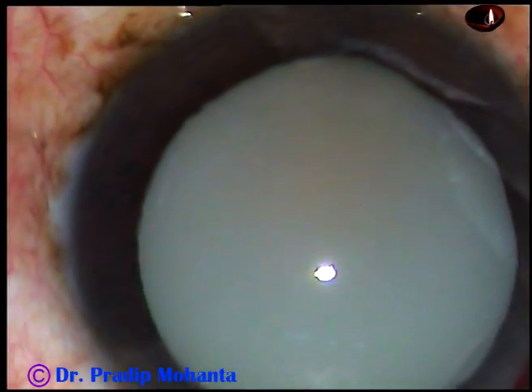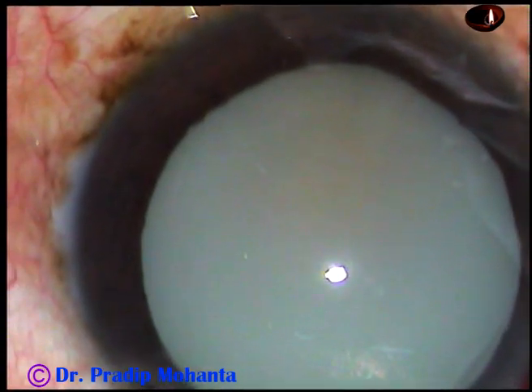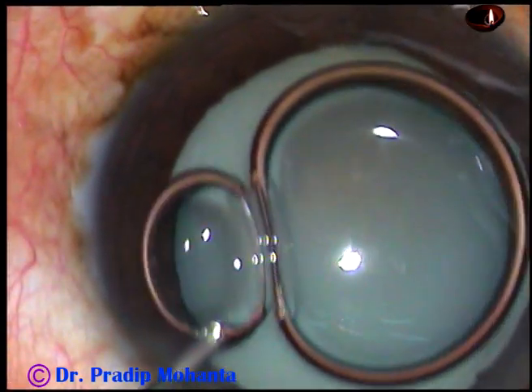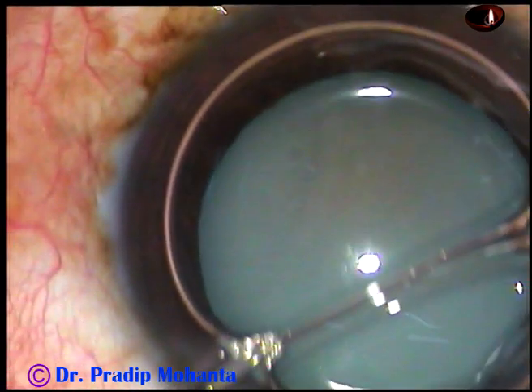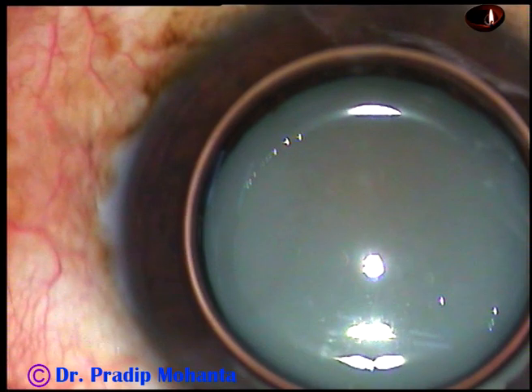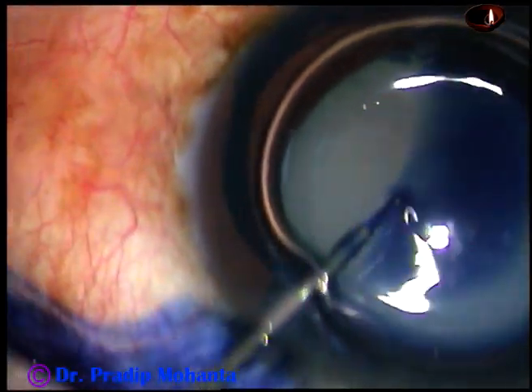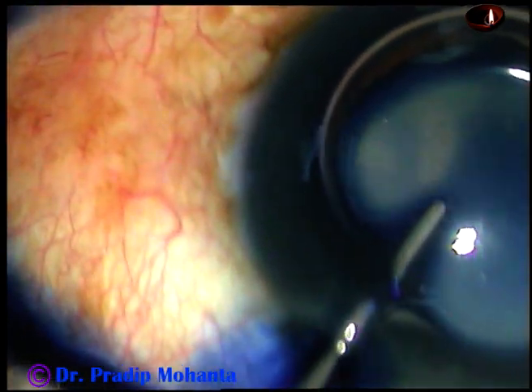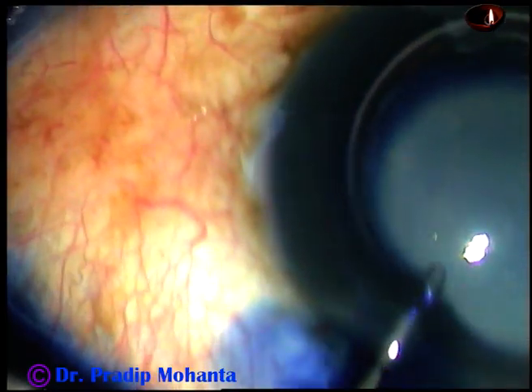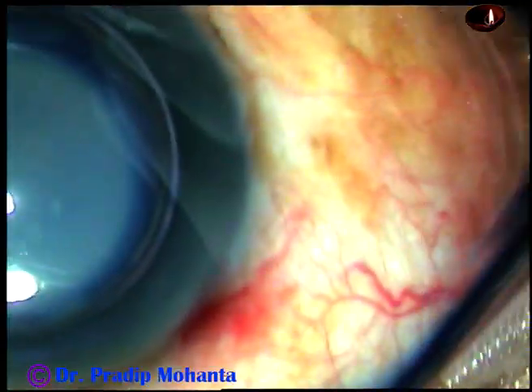The anterior chamber is filled up with an air bubble. The anterior capsule is stained underneath this air bubble with 0.06% trypan blue dye. The dye is applied in such a way that there is uniform staining of the anterior capsule.